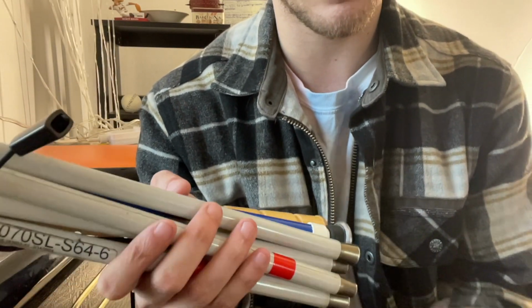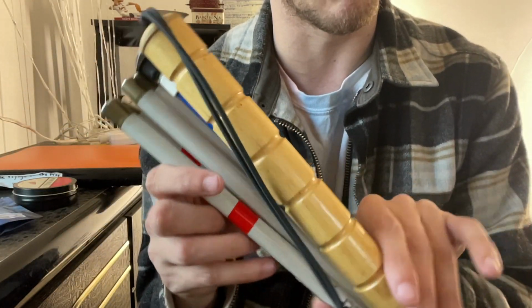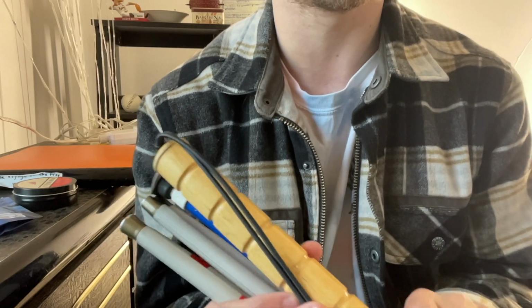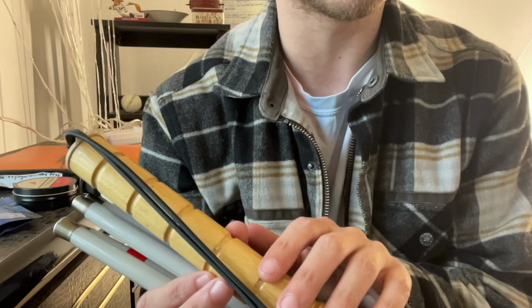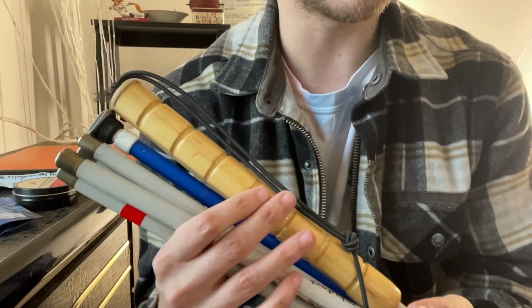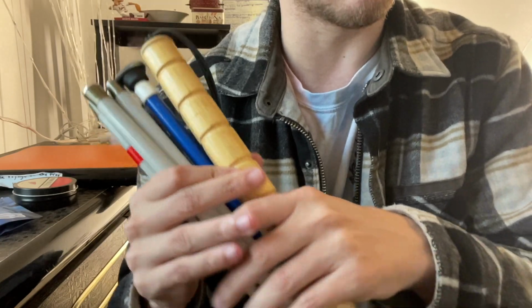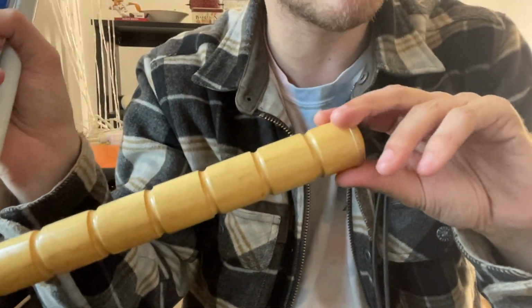And there are some features of this cane that may make it different than something you may have seen before. So the standard white cane, which has some elements on the second cane I'll show you, but the grip section is usually a golf grip style, which kind of means all-rounded with a flat section. Now this cane has a golf grip. However, rather than being made of a golf grip type rubber, this particular grip is made of wood.